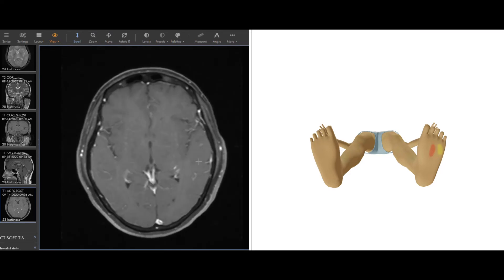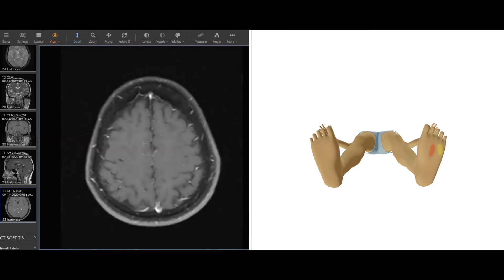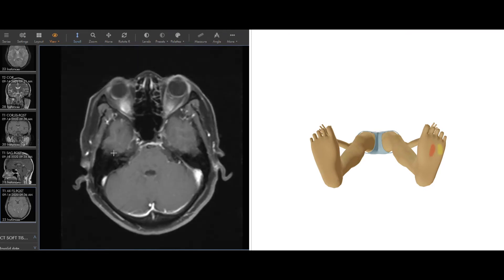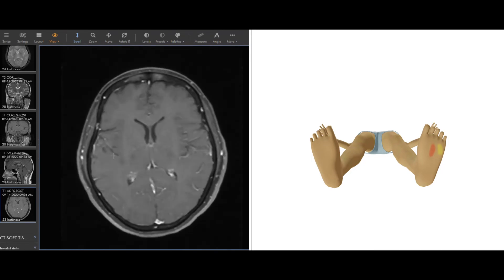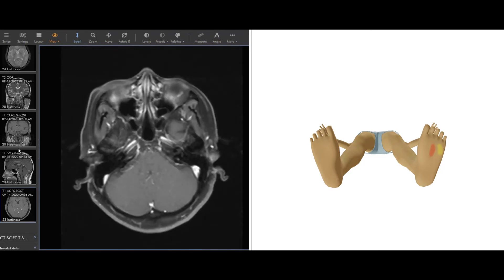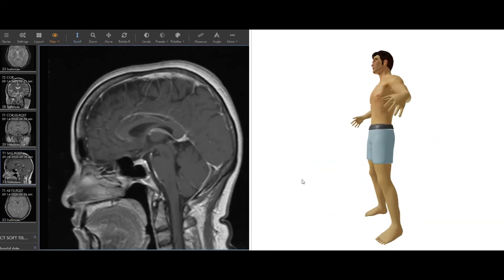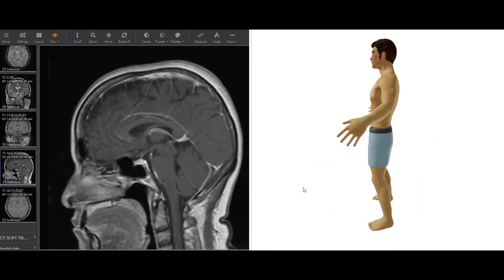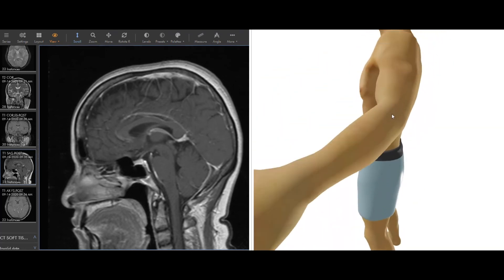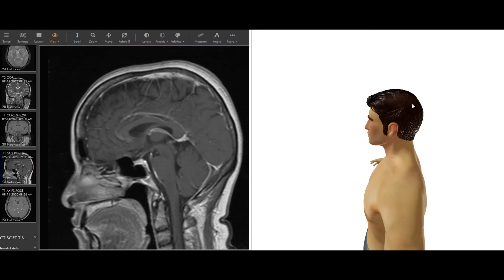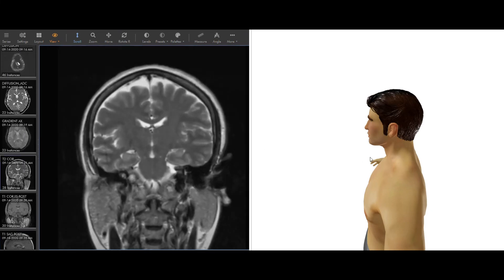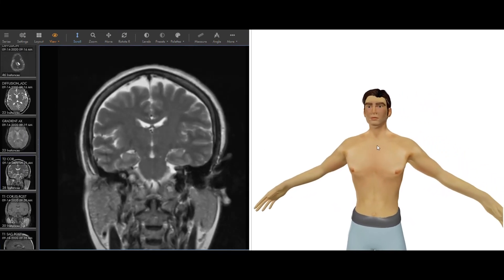This is a post contrast T1 image, and then you can see here it actually has FS. I talked about that before, that's fat sat. So all the fat in the scalp here is black, so that's also making things easier to see. The whole point of this is to make pathologic things or diseases easier for us to see. We can do a different view in this post contrast as well. This is from the side, so this would be in this area here. This is the pituitary gland, it has a lot of blood flow, so it's really bright.